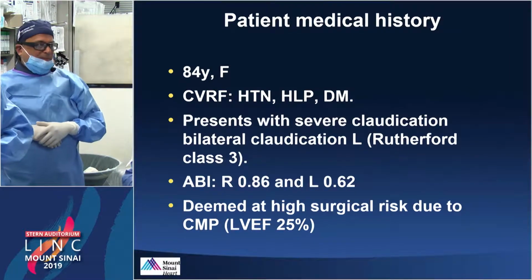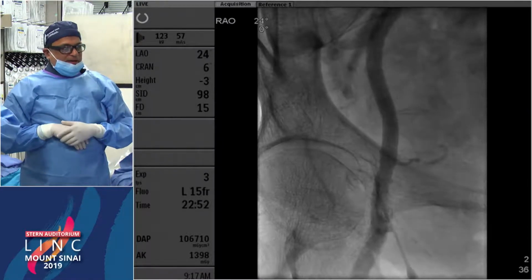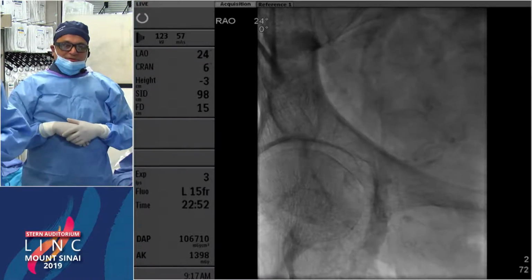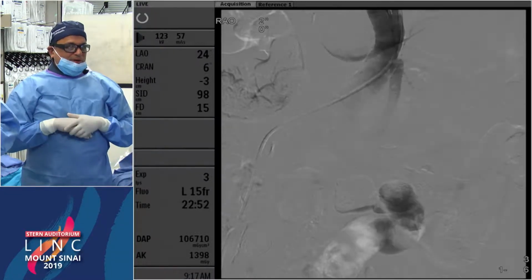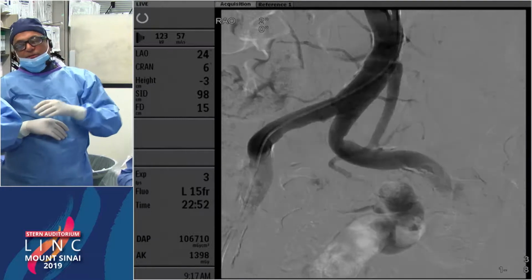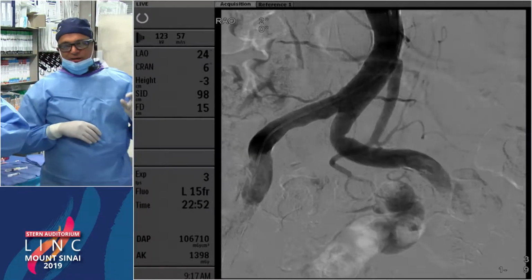This was done about 3.5 months ago, where he did a directional atherectomy. It was calcified, but not as calcified. And he did an impact balloon, a 7.0 by 40. And you can see he's got fantastic results, and the ultrasound follow-up has been good. In the meantime, we left her left common femoral artery alone, and now she suddenly, over the last month, has developed progressive rest pain. At the time of his angiogram about 3 months ago, she had a tight SFA stenosis distal at the level of the POP, and she had a 99% common femoral.